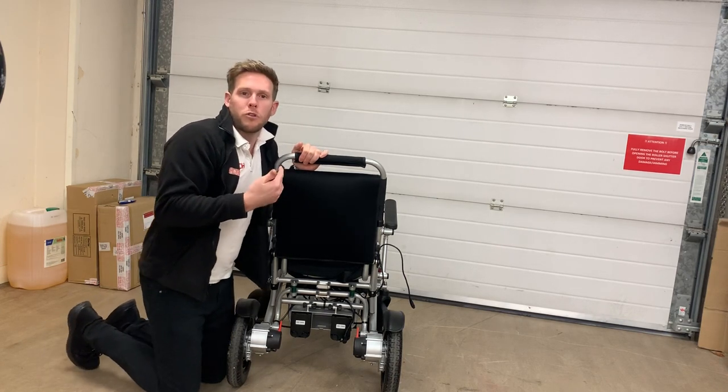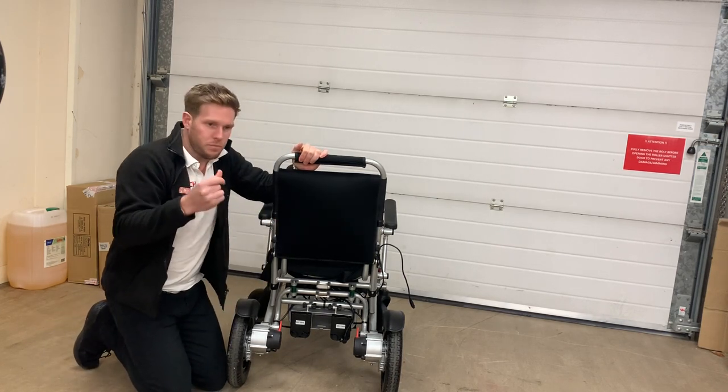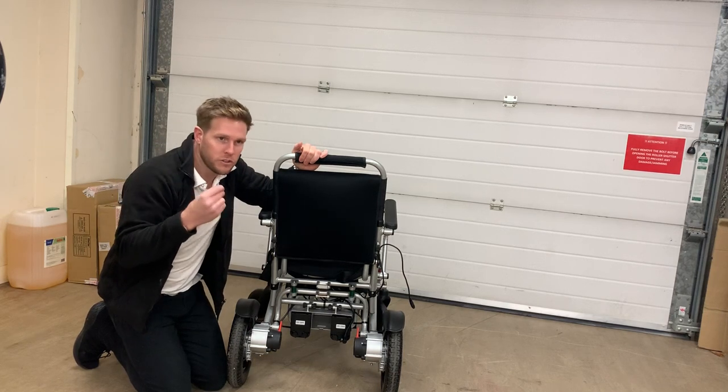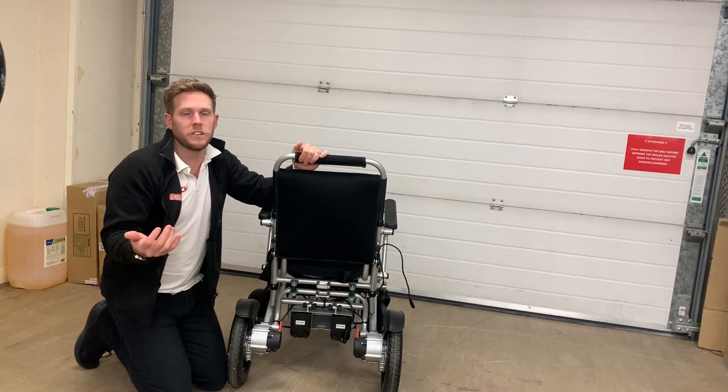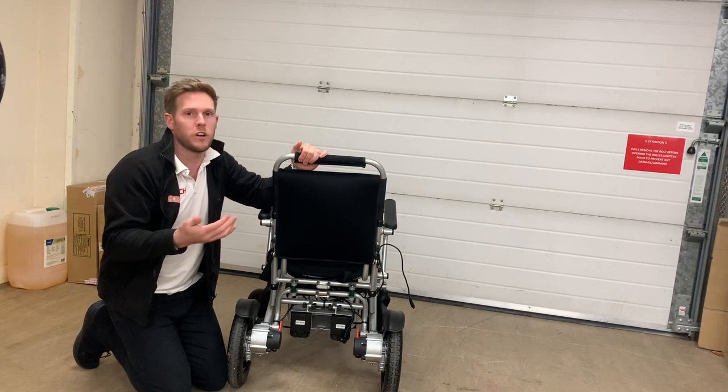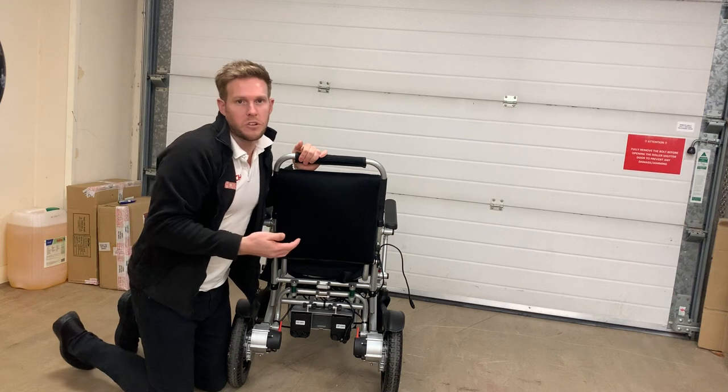The reason it's programmed to 0.5 seconds and not instant is because if you're going down a slope too fast and it stopped instantly, it could throw you forward in the chair, which is obviously unsafe. The whole point of our brand is to make our customers as safe as possible.